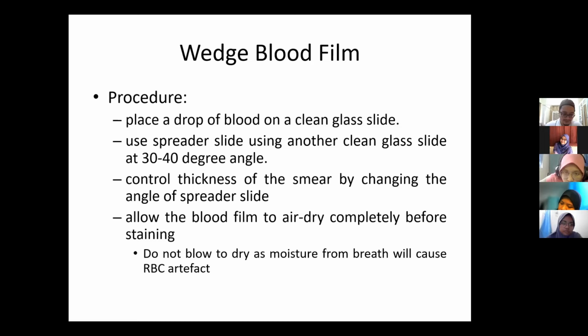So then you allow the blood film to air dry completely before staining. I always like to ask the student to imagine an airplane that is going to take off. Macam itulah keadaannya. Kapal terbang tu dia akan disuruh untuk berundur sikit, okay. Kemudian dia akan mula berlari dengan pantas di atas landasan dia. Macam itulah juga dengan smear tu.